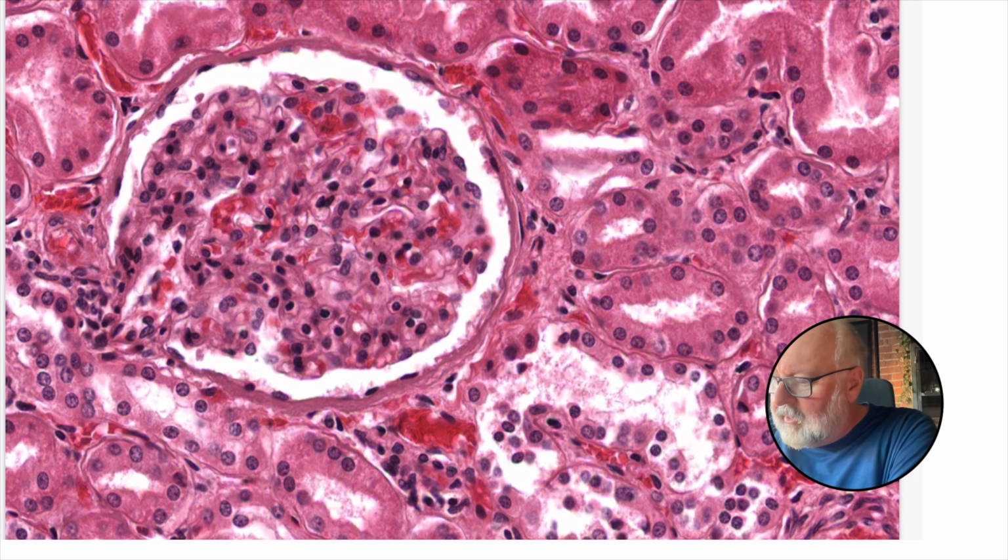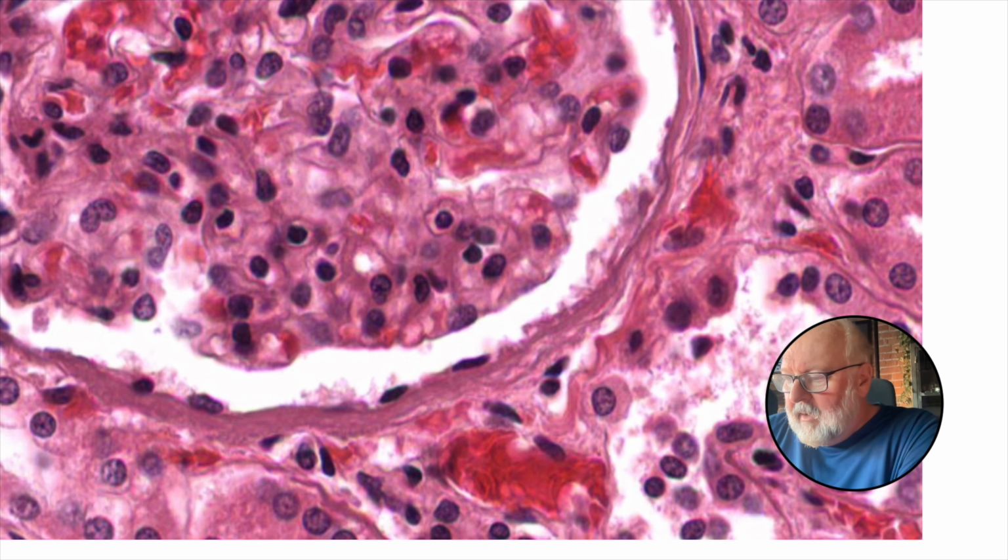And when we start to look, I'm going to zoom in. You can see, now these are not cells, these are the nuclei of cells. So we can't quite see the cell outline. You can kind of see a bit of a cell outline there, etc. What do you think this would be? Now I don't see other nuclei in this tissue. So this is telling me how many layers? How many layers do you think? One layer. So if it's one layer, it is simple.